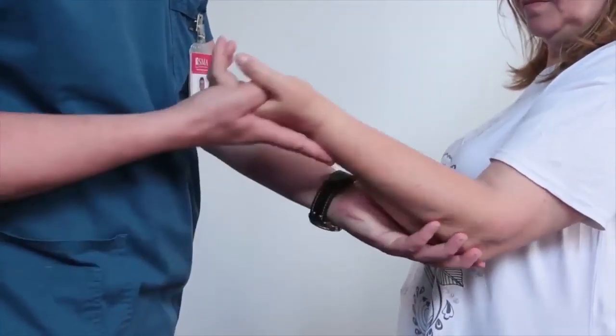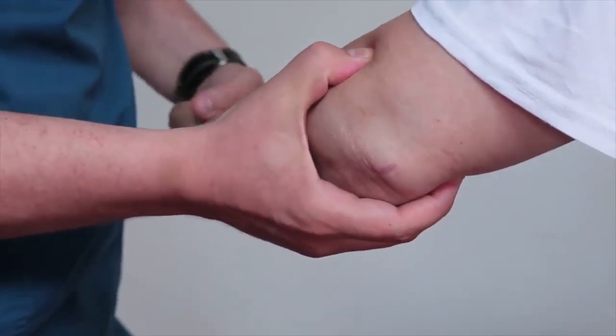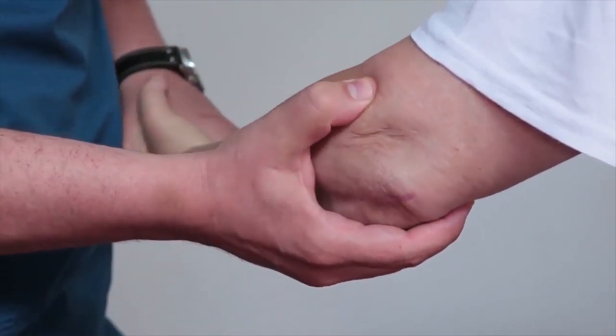The key to resolving contracture lies in highly intensive rehabilitation, started as soon as the elbow can be mobilized.